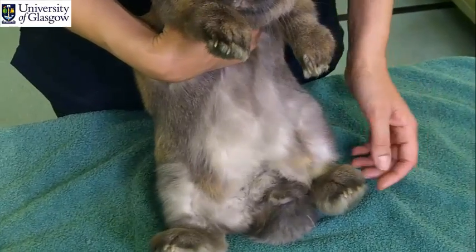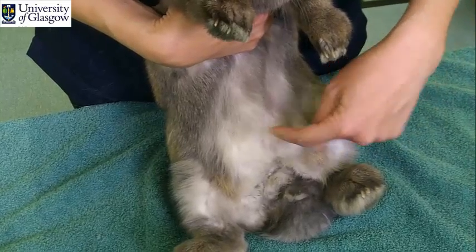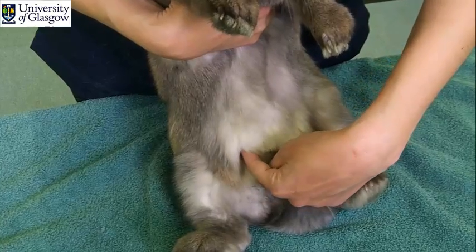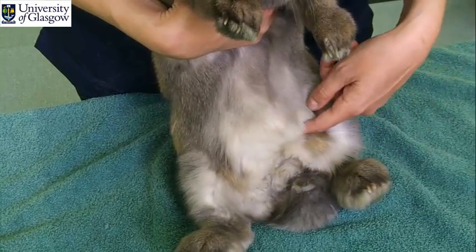If we have to do the intraperitoneal injection, we need to try to do it in the caudal quadrants of the abdomen of the rabbit. So if this is the umbilicus, the center of the abdomen, we will do it in one quadrant or the other quadrant. In this way, we try to avoid touching the cecum.